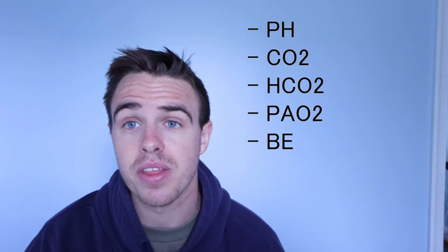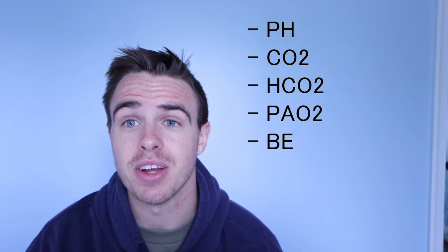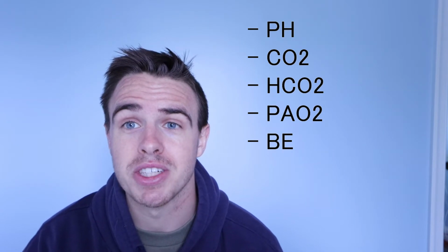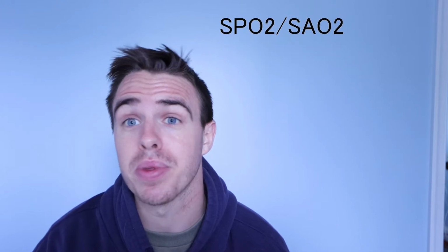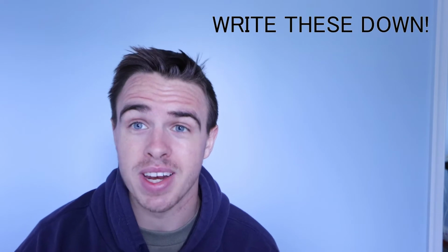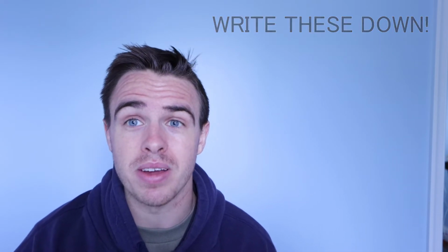Like I said earlier, the things that we can get from an ABG include the pH, the CO2, the bicarb, the oxygen, the base excess, and we can even look at the saturation of all the hemoglobin within the person. So I want to start off by telling you normal values, because you have to know normal values. If you ever look at an ABG, all you need to know is normal values, and if it's not in the normal range, then obviously this ABG is not normal.